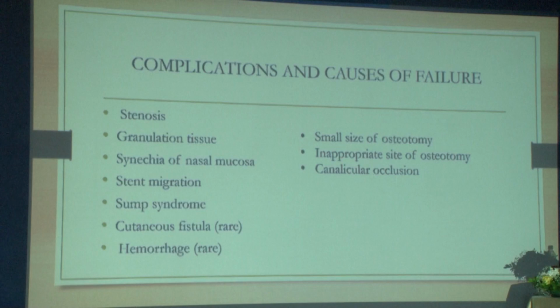There can be synechiae with the nasal mucosa, sometimes stent migration, and if the opening is not in the proper place, sump syndrome can occur. Sometimes a cutaneous fistula can occur, and failure is due to a small ostium, inappropriate site of osteotomy, or canalicular occlusion.